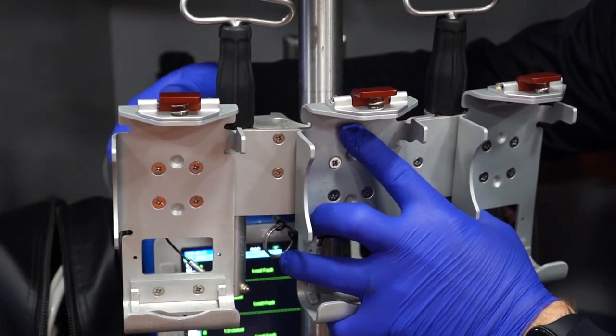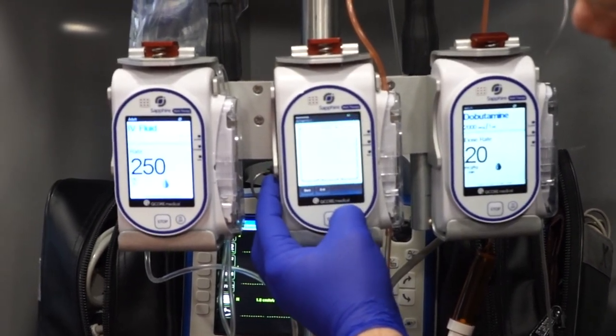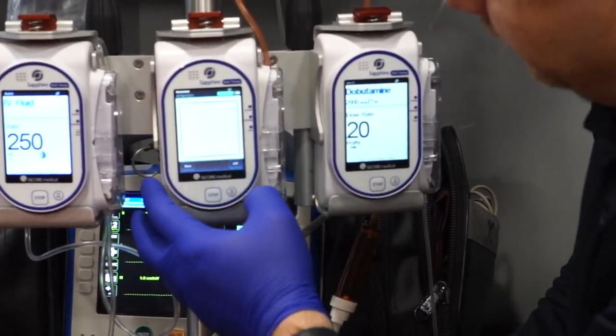Ferno Aviation makes a mount for the air medical world — they've got a single, a double, and a triple mounted pump option.